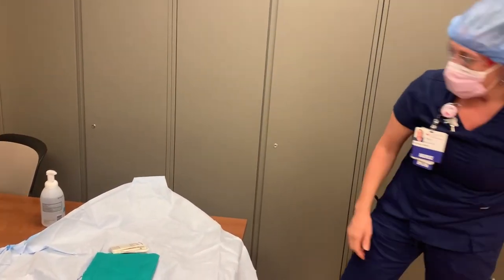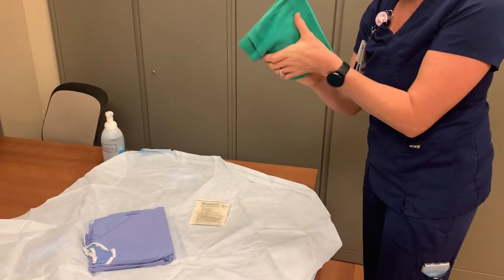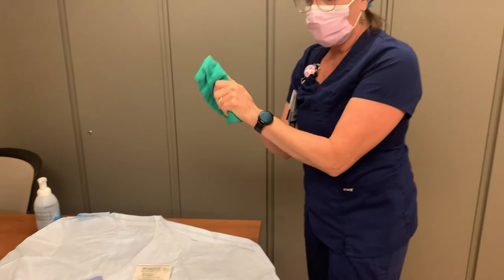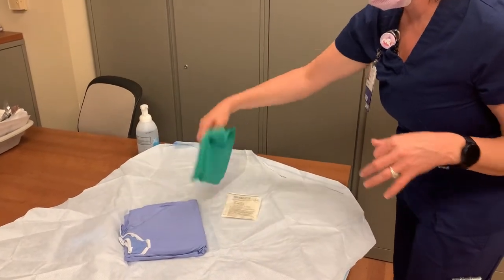You will open them during a later step. On the top of the gown is a sterile towel. You can use this towel to dry your hands if they are still damp from being washed. Otherwise, carefully pick it up without touching anything else on the sterile field and dispose of the towel.